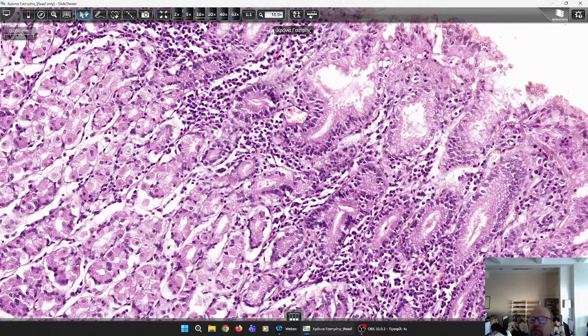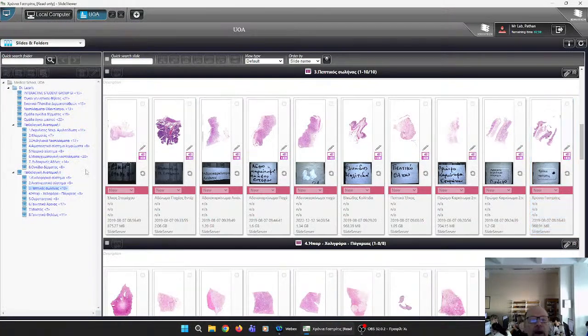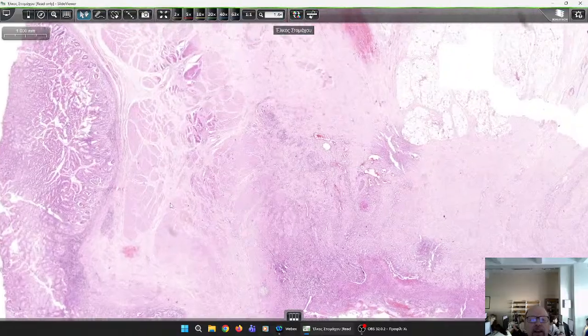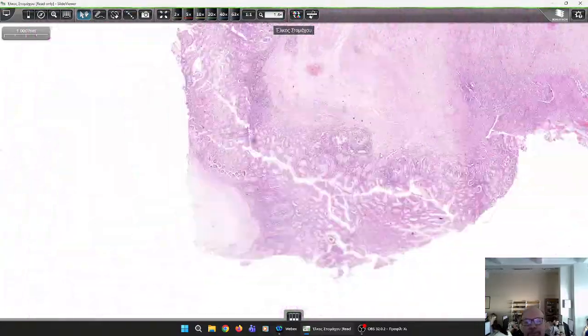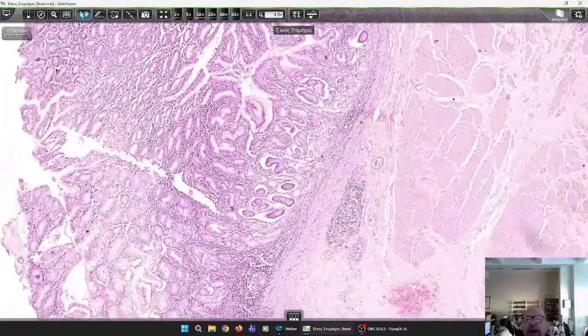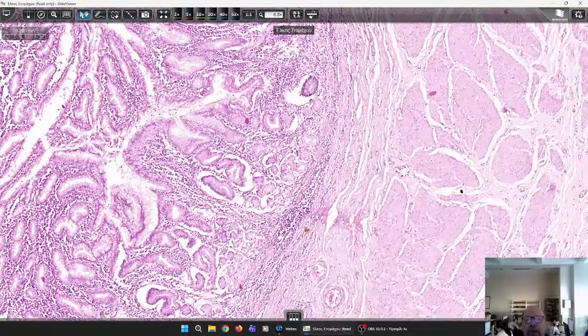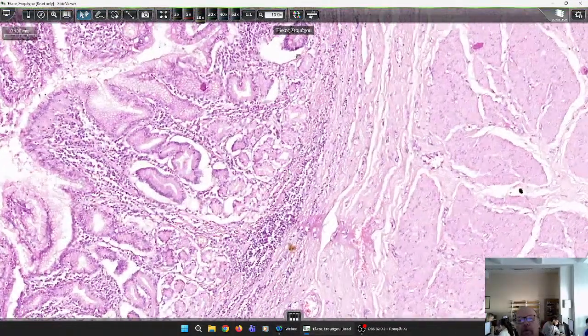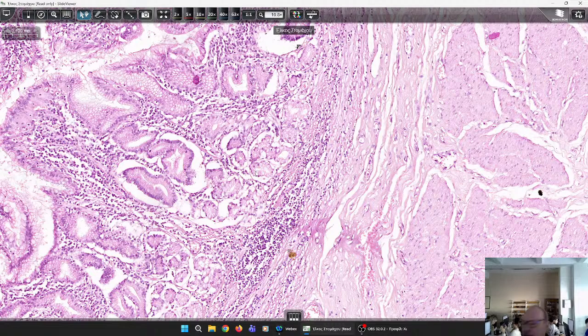This gastritis was superficial. However, this is not the case with this gastritis. Note the difference. It is very clear. Look, here we have another type of mucosa in which, in the deep mucosal epithelium, we cannot identify parietal cells.